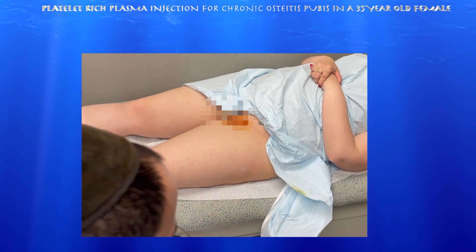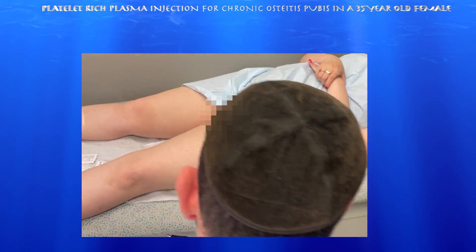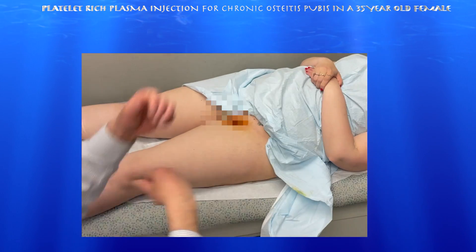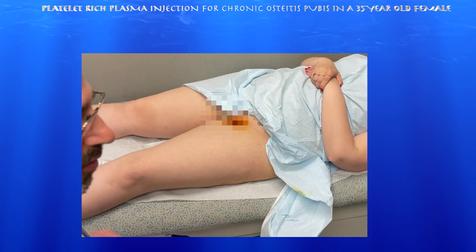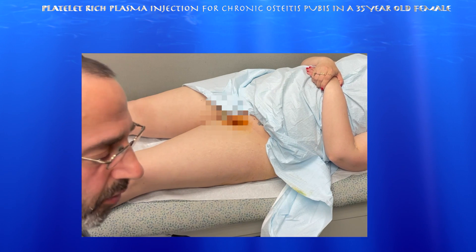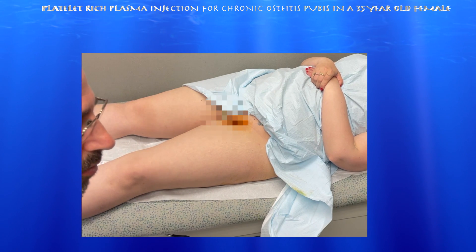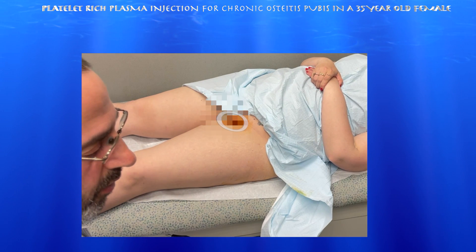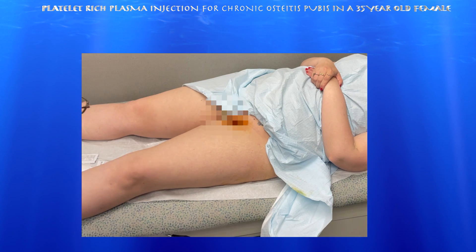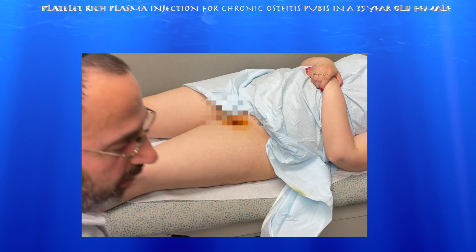Here we are going to do the injection for osteitis pubis on a very popular female patient. She's tender, perhaps a little bit distal to the bone at the origin of the adductor tendon, so we may focus a little bit there with the injection.